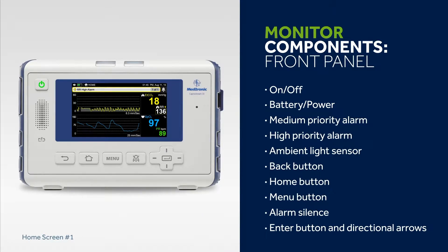The front panel of the KapnaStream 35 Portable Respiratory Monitor features a brightly coloured, easy-to-read display screen, power and navigation buttons, plus status indicator lights. These include on-off, battery power, medium priority alarm, high priority alarm, ambient light sensor, back button, home button, menu button, alarm silence, enter button and directional arrows.